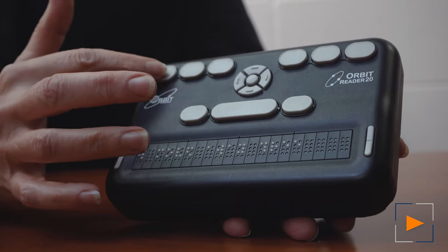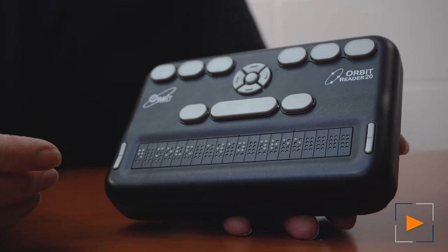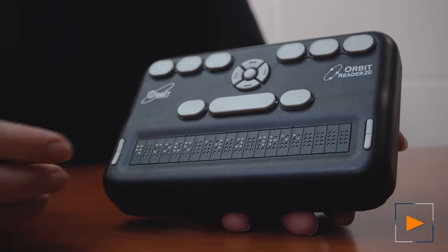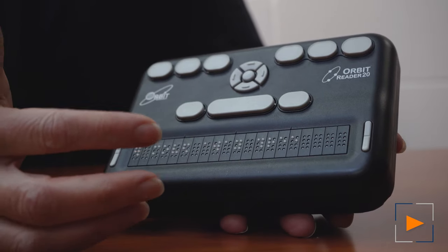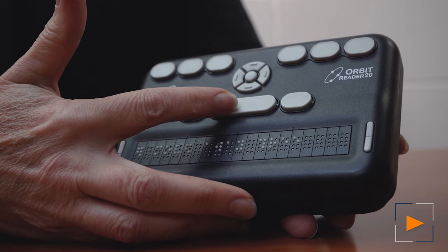You have the 6-key entry for Braille — 1, 2, 3, 4, 5, 6 — just like on a Braille writer. And then you have the 7 and 8 key for backspace and enter, along with the spacebar in the center.